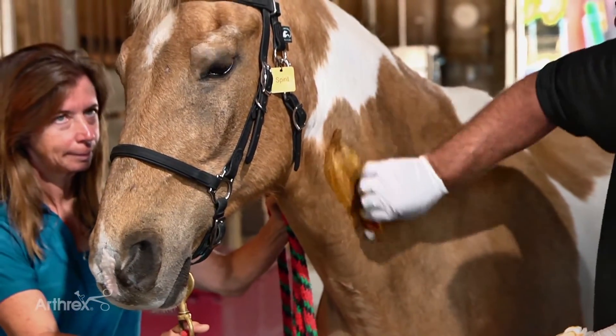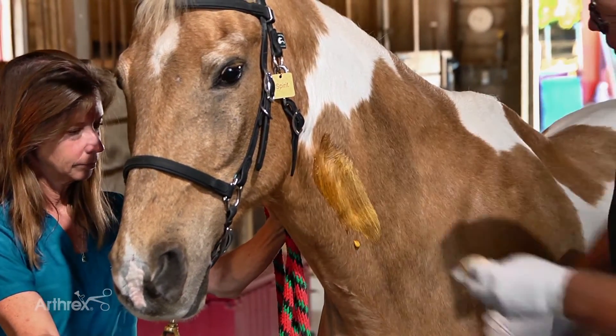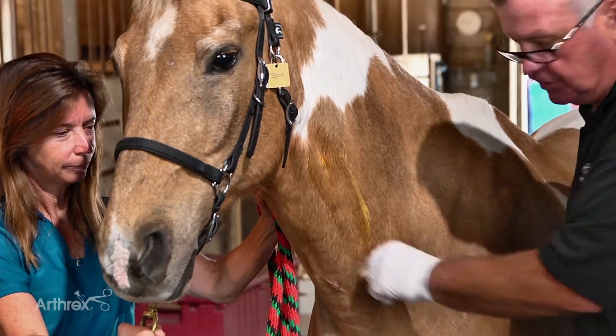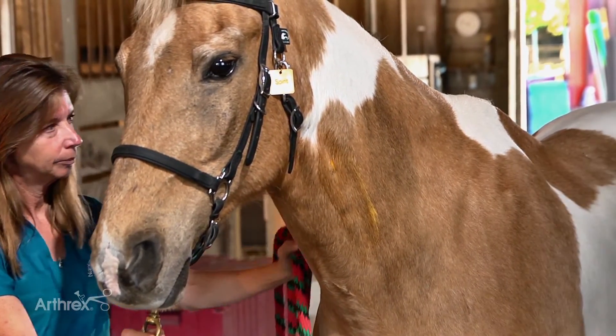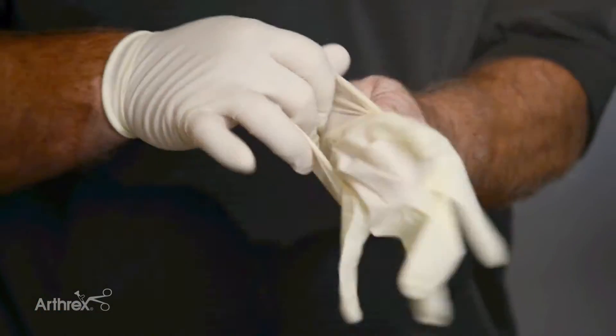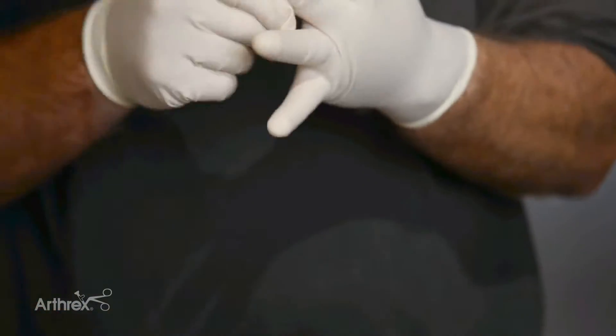Preparing the jugular vein is done in a similar manner for the Angel as was done for the other products that we've discussed. We like to get the jugular as clean as possible. What I like to do after scrubbing the jugular vein is to utilize sterile gloves.